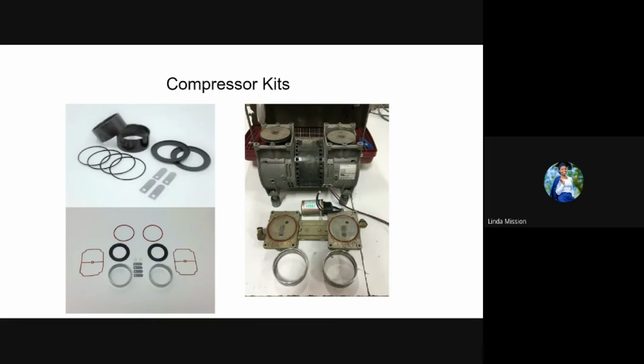So let's make sure that we pay attention to the sound being produced by the concentrators. The images in the graphics just show some of the components found inside an air compressor in oxygen concentrators.